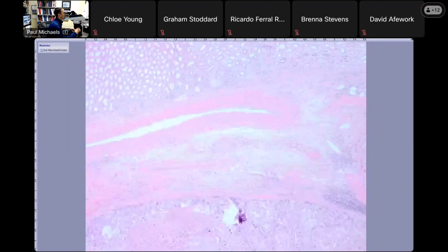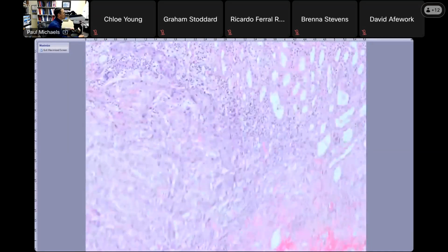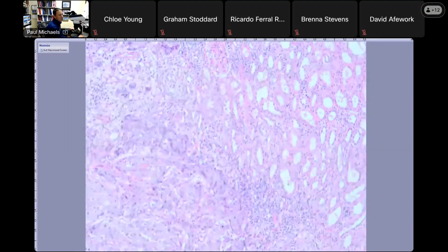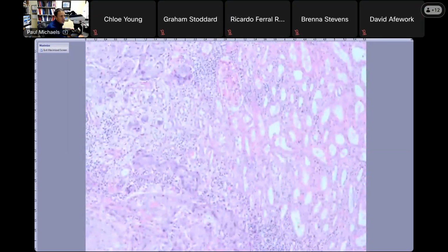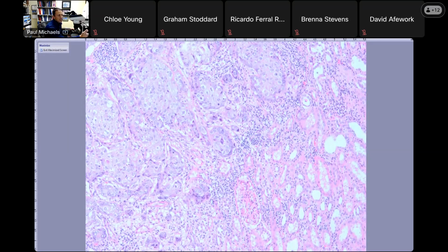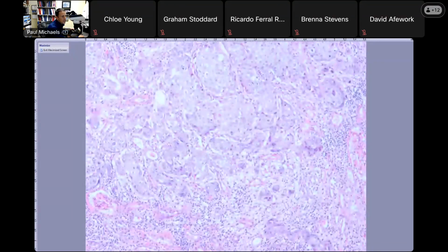They often infiltrate deceptively into the kidney parenchyma, whereas renal cells don't typically do that. Here you have the medulla, and you have the tumor kind of infiltrating. The things that do that are collecting duct carcinomas and urothelial carcinoma. So that should be in your differential when you see that growth pattern. But if you see something like this, it looks like it could be a renal cell carcinoma. But then you really have to look more around.